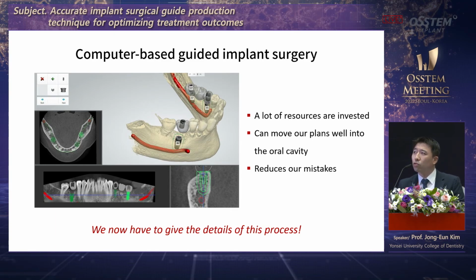As of late, these surgical guides are used very frequently compared to the past, and I'm sure you have a lot of experience in designing and fabricating surgical guides. A lot of energy is spent. You need to do a lot of planning. You need to prepare ahead. As you can see, there are ways to minimize mistakes and realize our plans into the oral cavity. There are many technologies that help us do that.